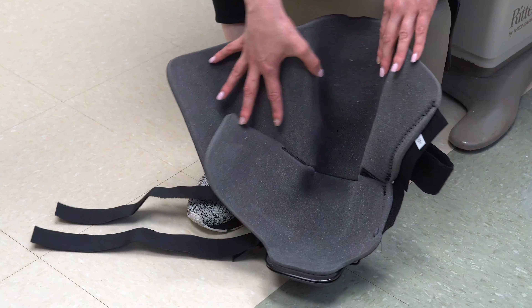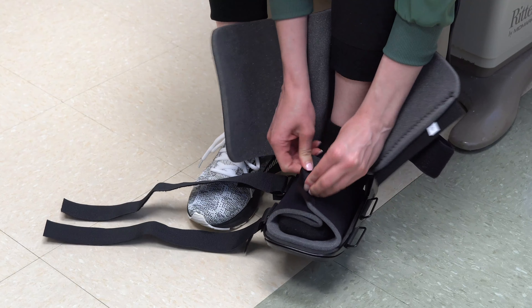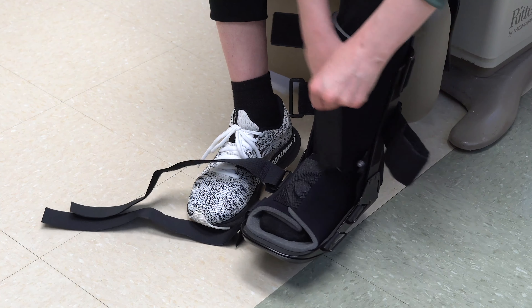When wearing the cam boot, first you're going to place your foot in the boot and make sure that your heel is all the way to the back. There are two big velcro straps — one goes over the top of your foot and one goes over your shin.